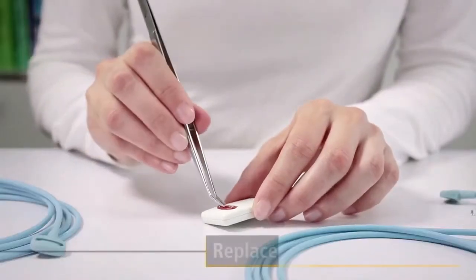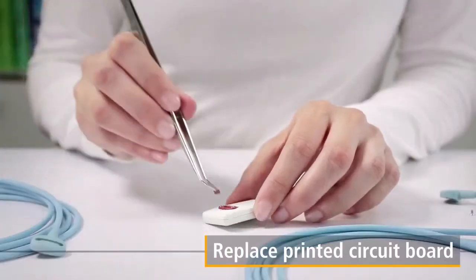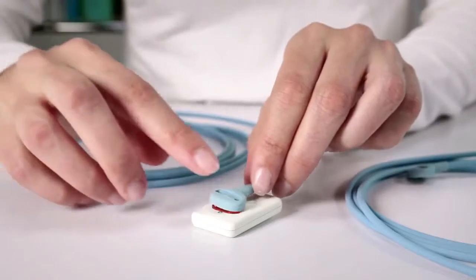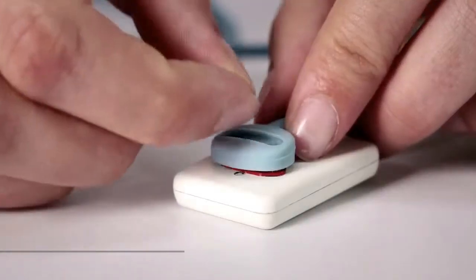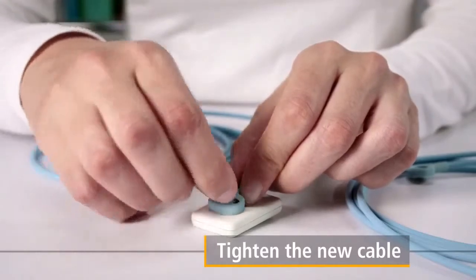Use tweezers to replace the printed circuit board with the new printed circuit board included in the replacement cable kit. Finally, hold the new cable in place, tightening the two small screws with the screwdriver and attach the cover plate.